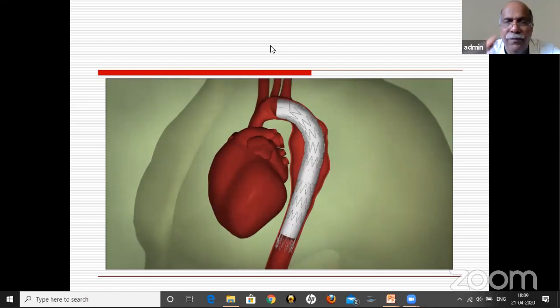And you have to have significant length below the aneurysm segment. Aneurysms, yes. One problem we have faced, and it's currently asymptomatic: when we have done a candy plug, we used a Medtronic graft for the main dissection, and we used a Cook graft for the candy plug.